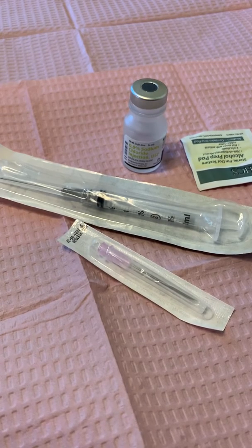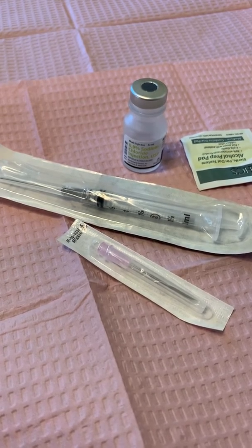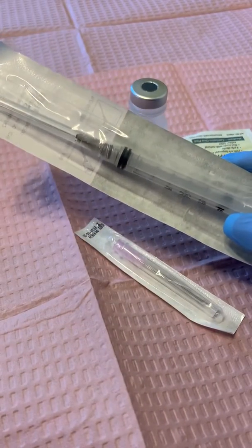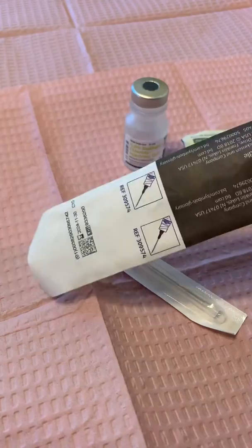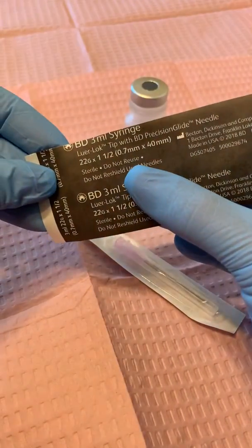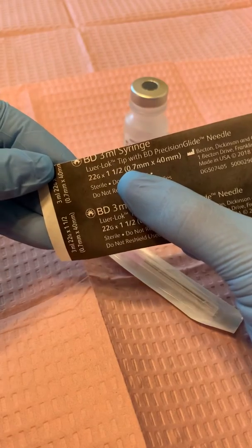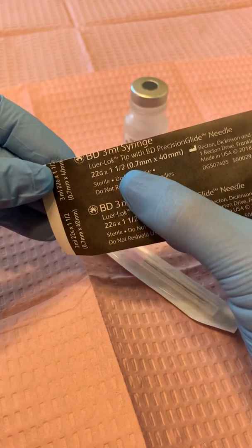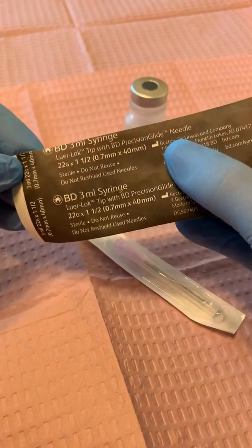Hello class! In this video we are going to draw up some medication in a hypodermic syringe. This one has the capacity of 3 mils — so we have a 3 mil syringe. It is a luer lock. It has a 22 gauge needle and it's one and a half inches long.